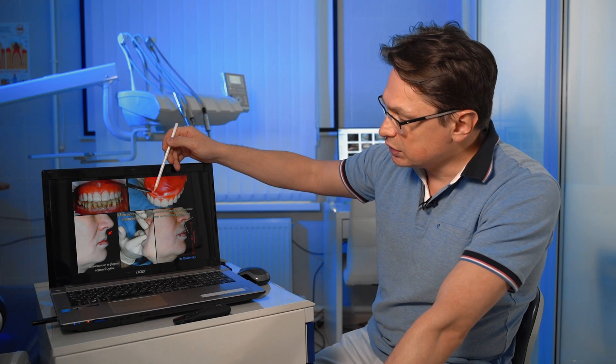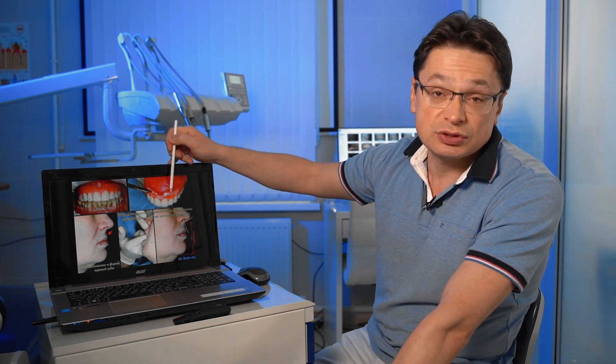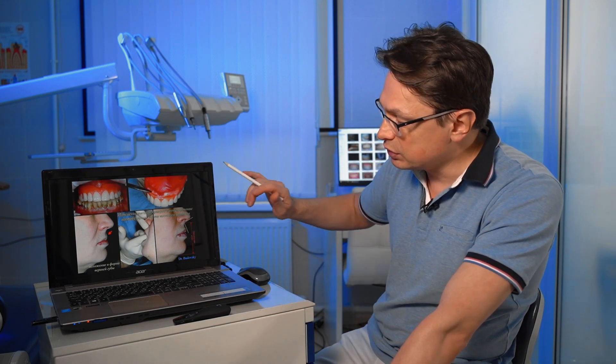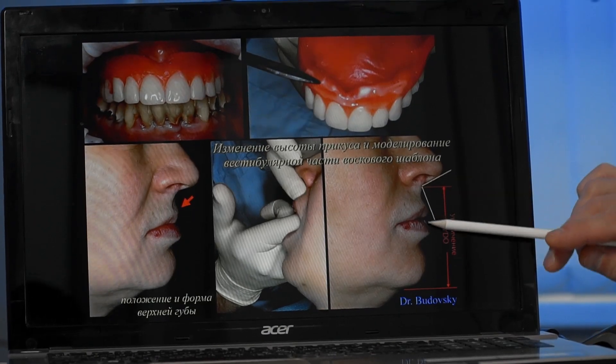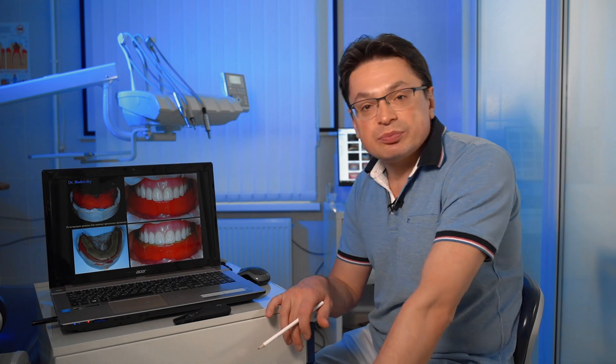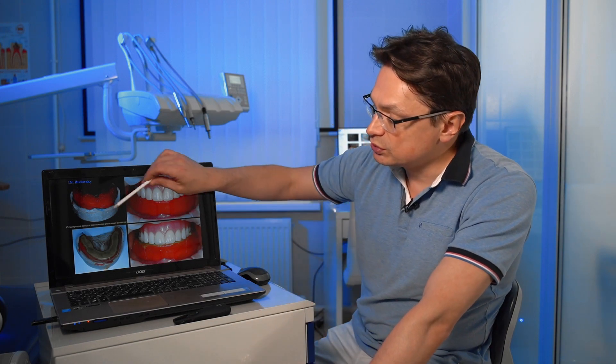You can see that in this case I model the front part with a temporal removable prosthesis to achieve the correct position of the upper lip. There are special angles that allow us to control this. If you watch the video about registration of the central relation, you will see that for patients with full edentia we register the centric relation with aluwax. You can see it here — we don't use a full basis, only the aluwax part, in order not to create a pushing effect.